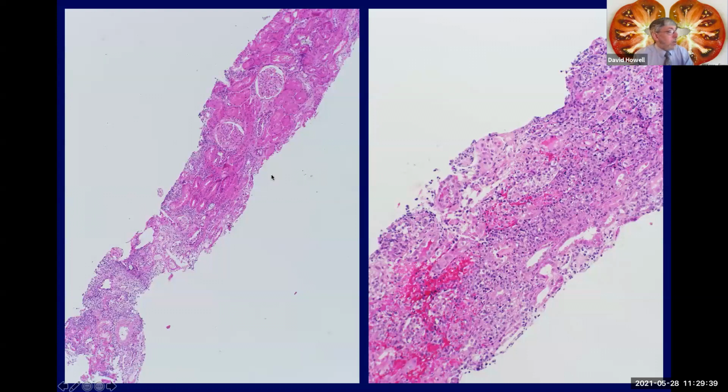So here's his biopsy at low power, and this is the hematoxylin and eosin, or H&E, stain. We have cortex here, a couple of glomeruli, tubules. They're back to back without much in between them. This actually looks kind of normal at this magnification. And you wander into this really bad zone here where something very different is going on. We can see this at a little bit higher power over here. There's hemorrhage. This pinkish stuff is necrosis.